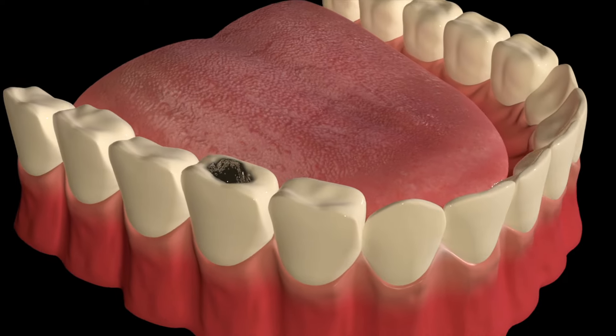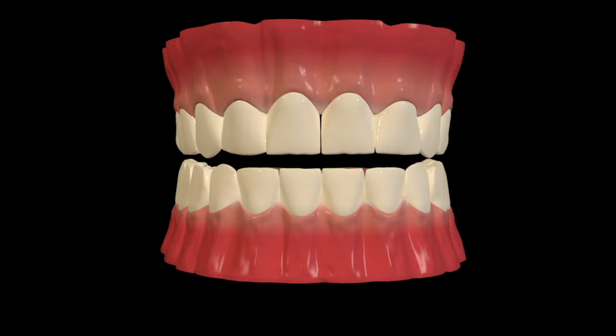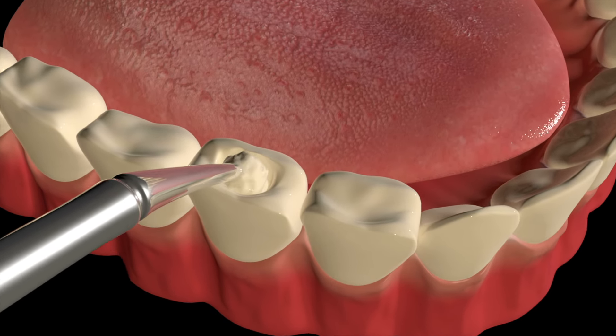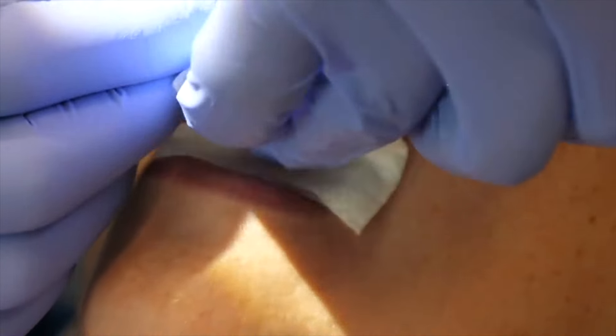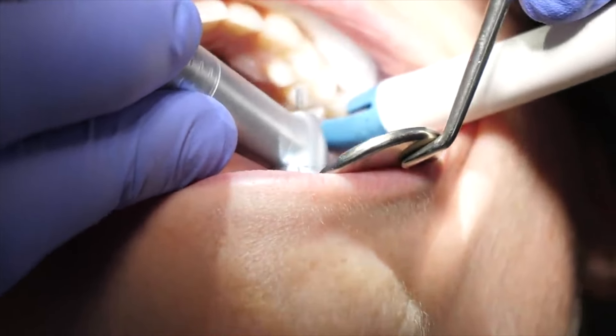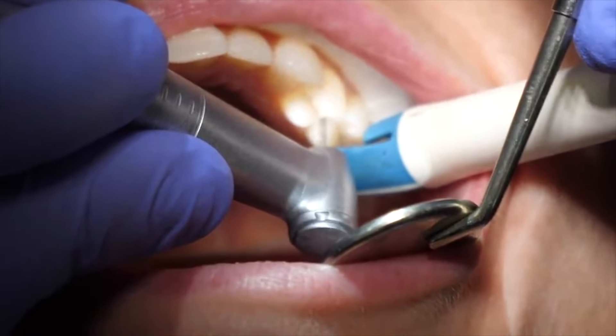Opening it up means the dentist told you they see a cavity on your x-ray, so they will need to remove it — opening it up to remove it and fill it, also known as a filling. Once you're numb, they will numb the tooth up with local anesthetic so you're comfortable and won't feel anything. Then they will remove the decayed area, the tooth decay area of the cavity.